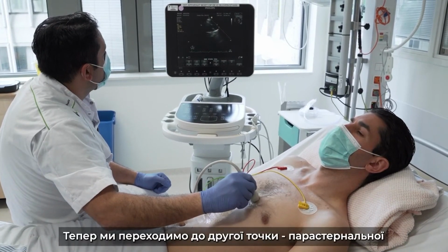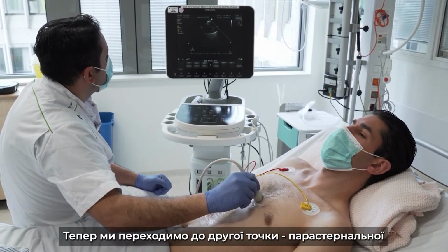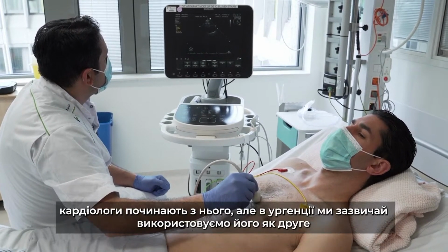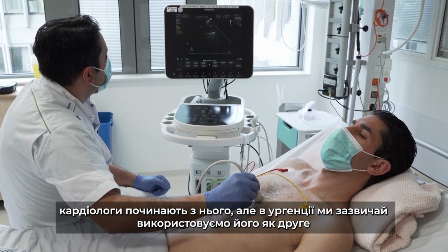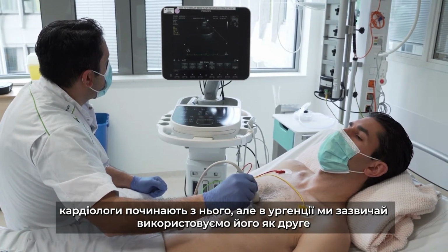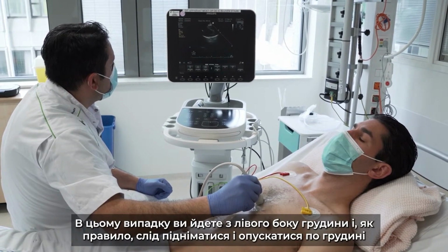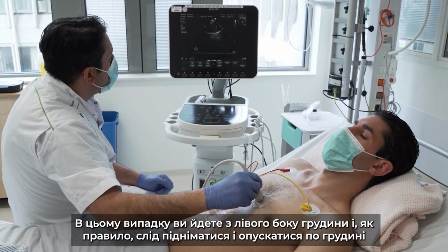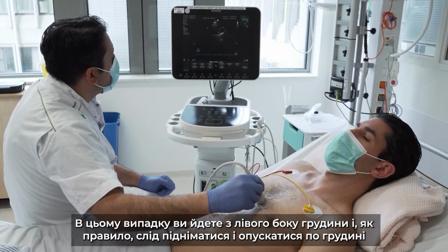So now we go to the second cardiac window, which is the parasternal view. Cardiologists will begin with this window, but in acute medicine we usually use it as a second. In this case you go on the left side of the sternum, you look for a good window.